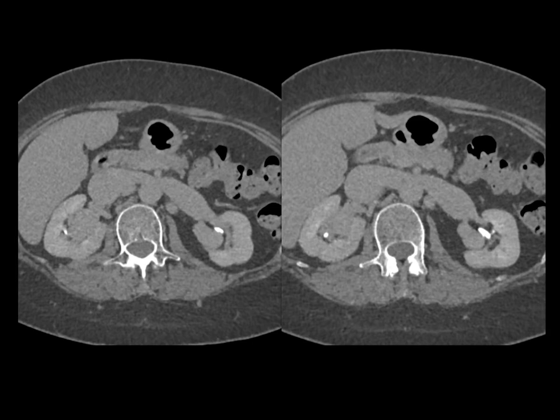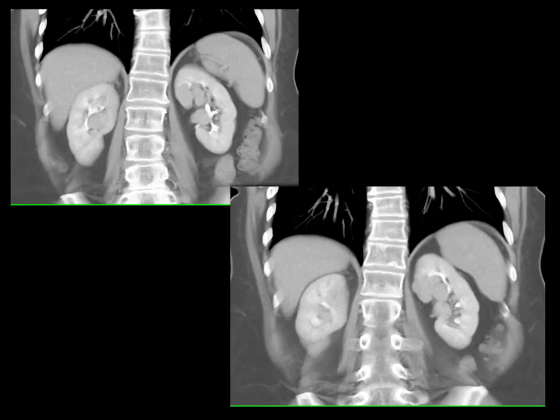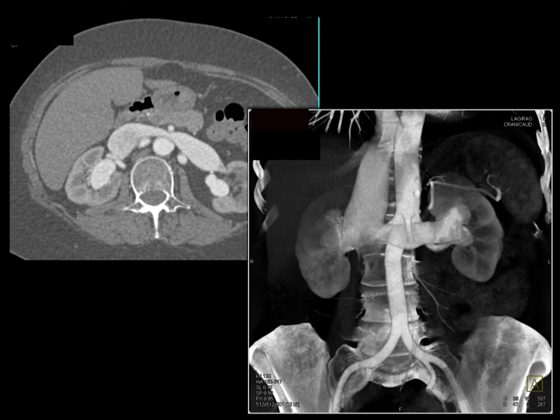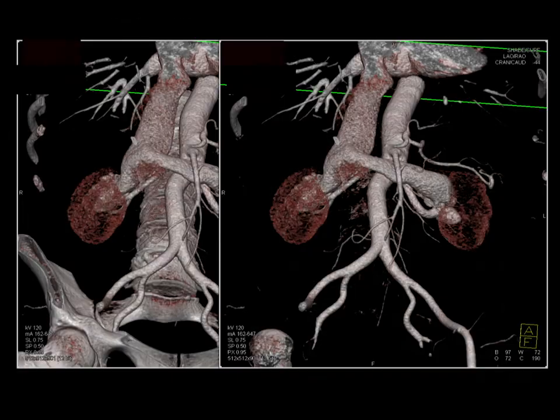Here's a great example. Look at the non-contrast scan — the renal veins look big, the kidneys show fullness in the pelvis, maybe parapelvic cysts, but it's not the low density of parapelvic cysts typically. On the excretory phase the renal veins still look big, pelvices look full. But if you have the arterial phase, look at the AV shunting — the vascular enhancement of the venous and arterial structures simultaneously with these AV fistulas in both kidneys.